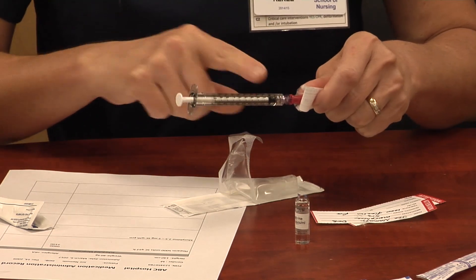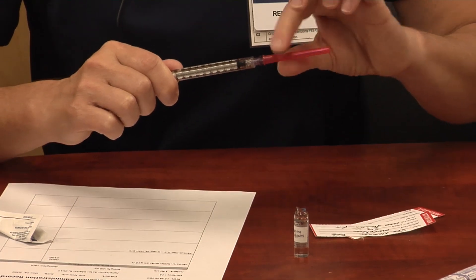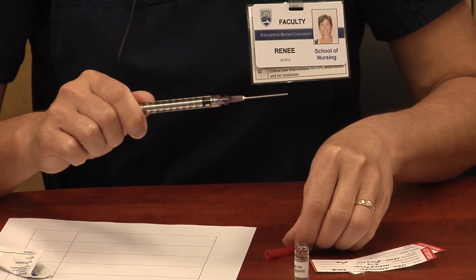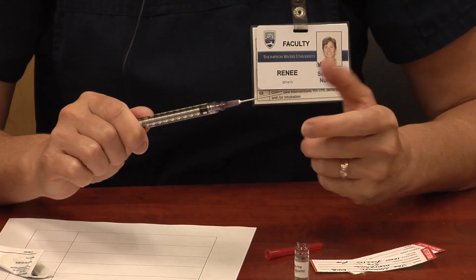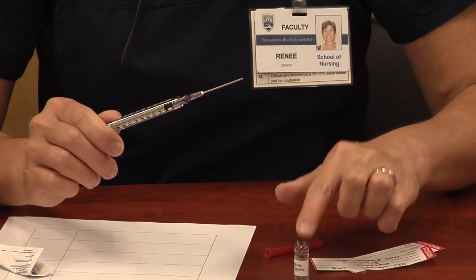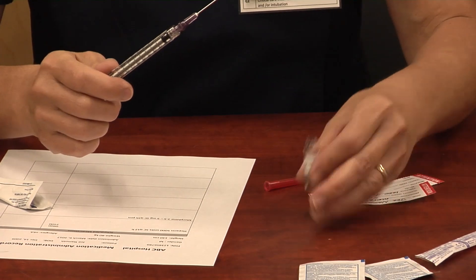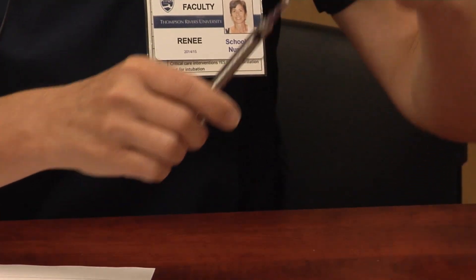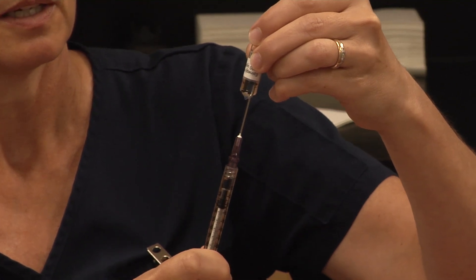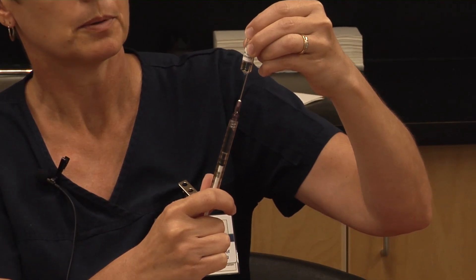We've used principles of asepsis — not touching any of the connectors. To take the caps off, you just pull straight off and lure lock it on so things stay connected. You can approach drawing up a couple of ways: if you're having a shaky day, keep the ampoule on the table and insert the needle that way. Other days, you can invert the ampoule and draw up the medication that way.